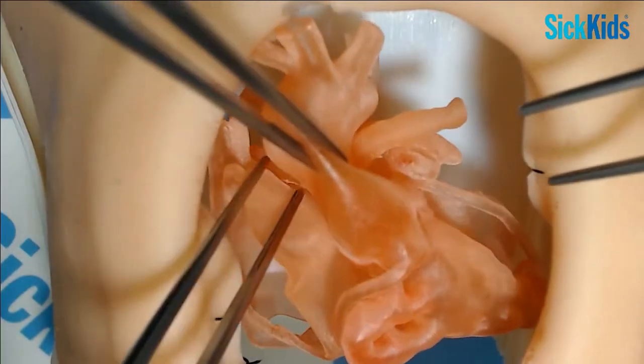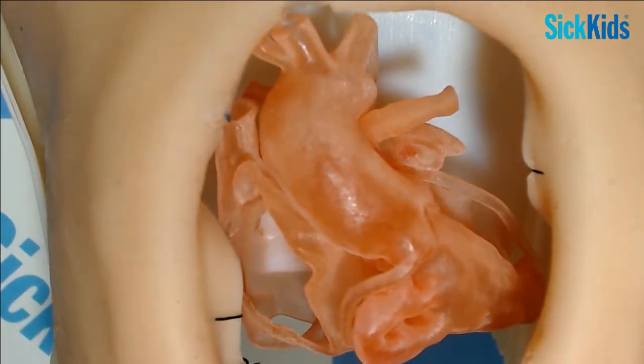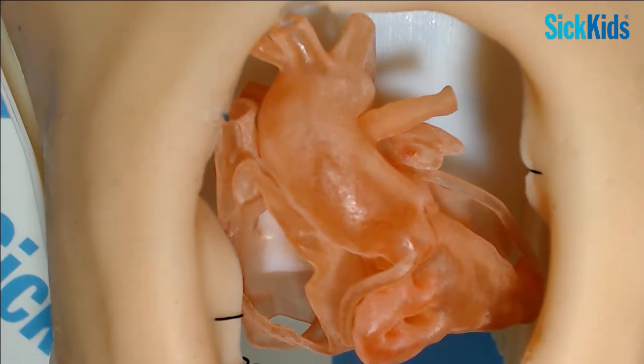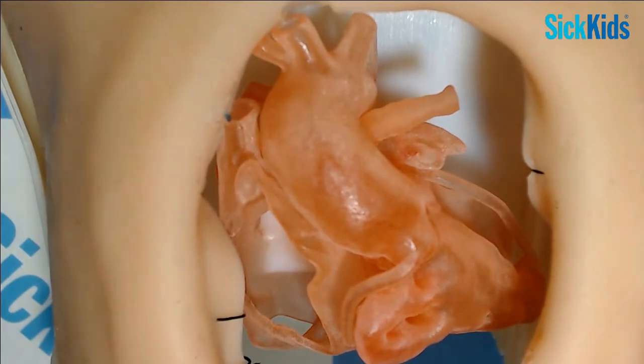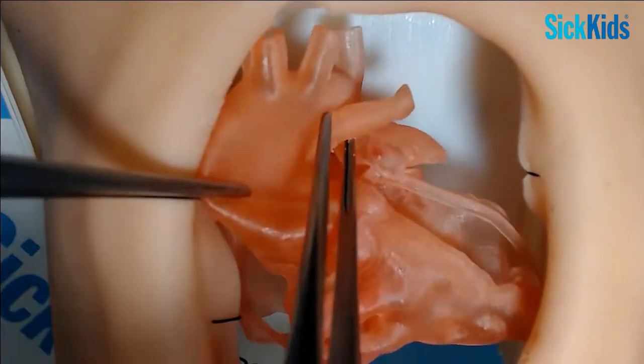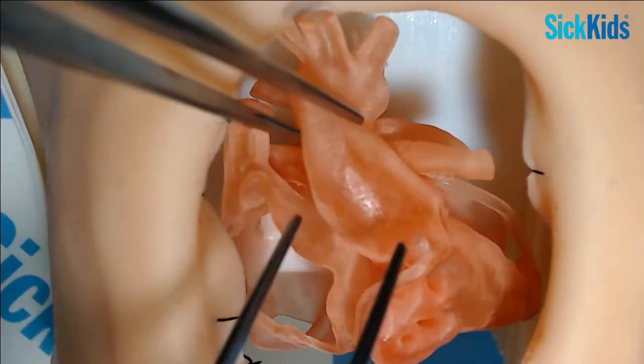I think the Van Praagh classification is much more relevant because it doesn't worry so much about where the pulmonary arteries come off. It talks about the important variants, which are truncus with interruption, which is type 4, or when the LPA comes off like a duct, which is type 3. And type 1 and 2 are really just the Collett and Edwards classification. Anyway, they come off the back, so you've got to look at your trunk and work out how you're going to manage it in terms of bypass.